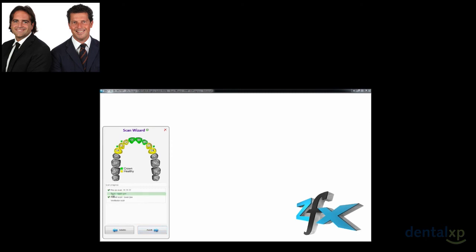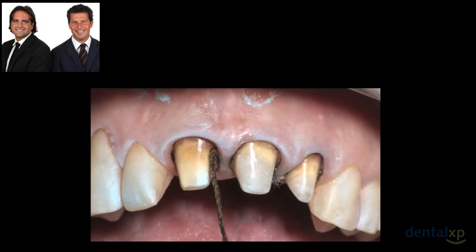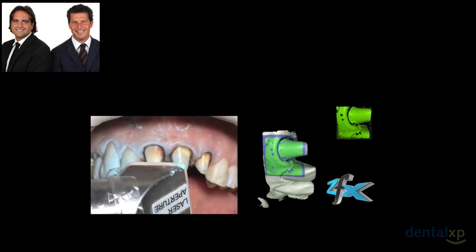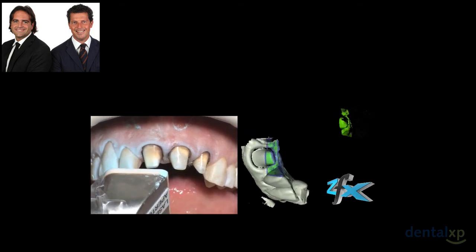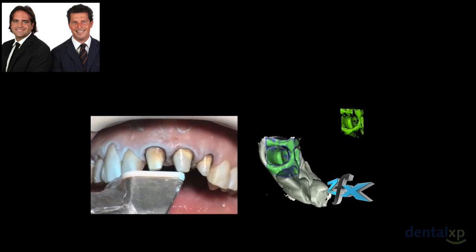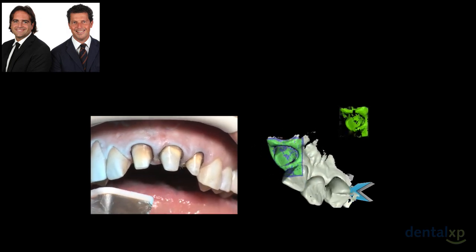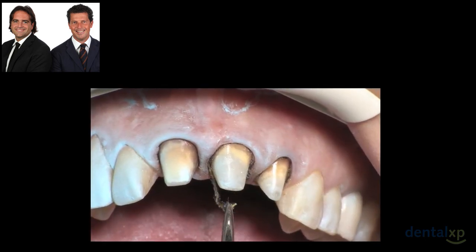Okay, now I'm gonna present you one of the biggest advantages of the digital technology, of the digital intraoral scanner. We can take the scan of one abutment at a time, so we can leave the cords in place much longer than with a traditional impression. And you can see here clinically and on the computer screen how the scannerization is evolving. You can see here also the scan has like 2 centimeters as working distance.